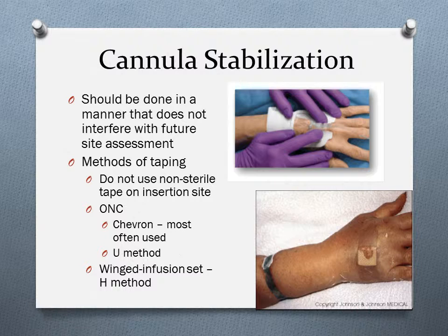And look at the infusion nursing standards of practice, because it stipulates that sterile tape should be used underneath a site dressing. And if you use a single-use IV start kit, realize that everything in that start kit before you open it is sterile, and it does include tape.